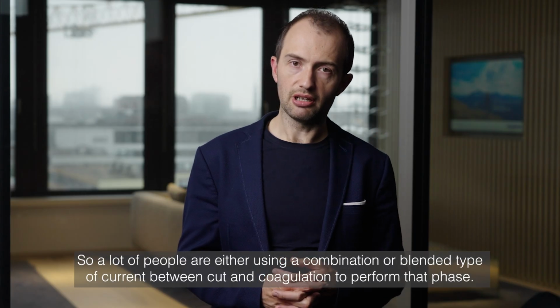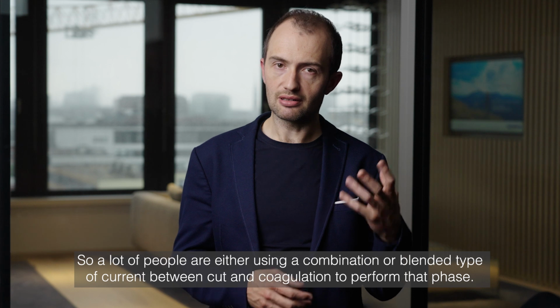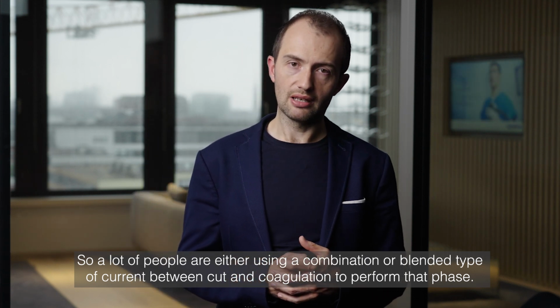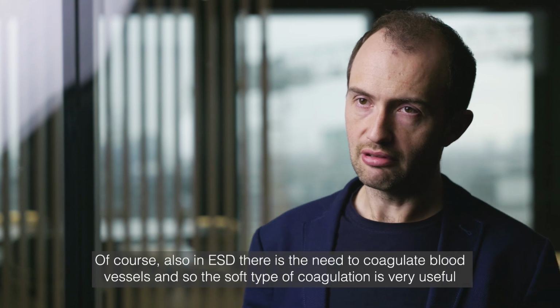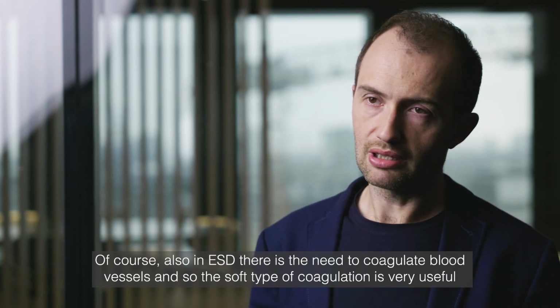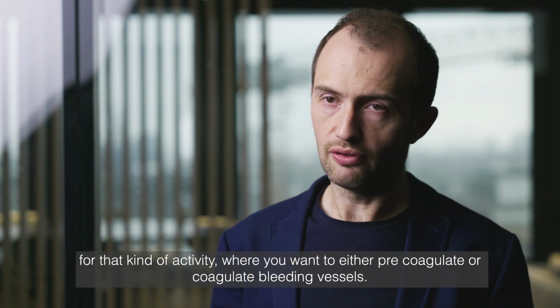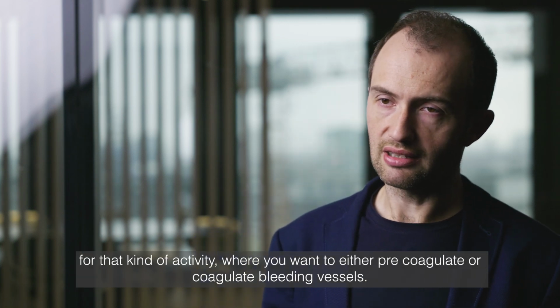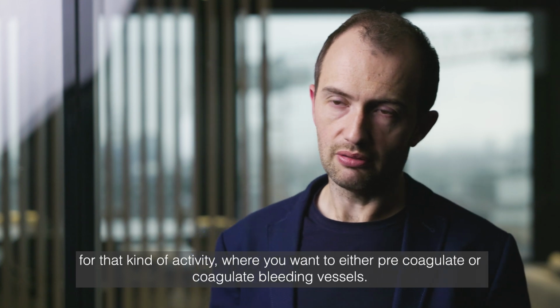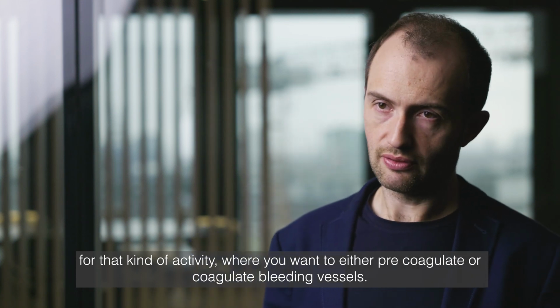So a lot of people are either using a combination, a blended type of current between cut and coagulation to perform that phase. Of course, also in ESD, there is the need to coagulate blood vessels, and so the soft type of coagulation is very useful for that kind of activity where you want to either pre-coagulate or coagulate bleeding vessels.